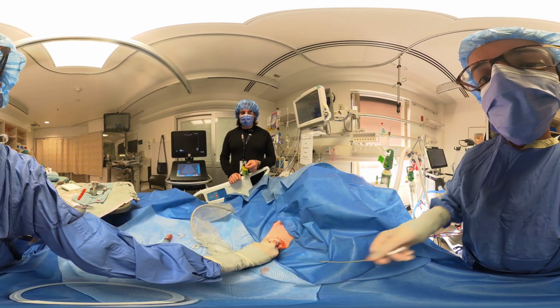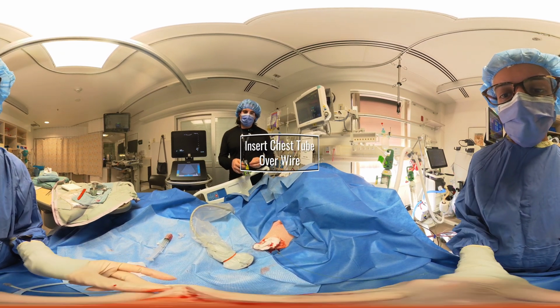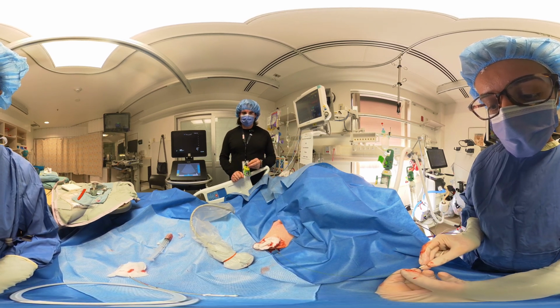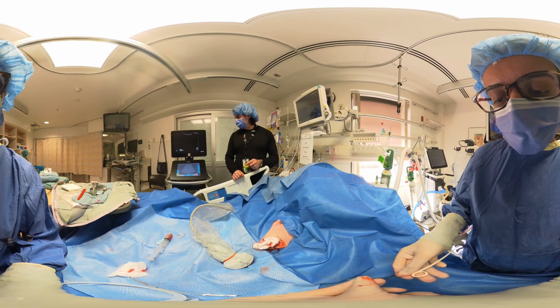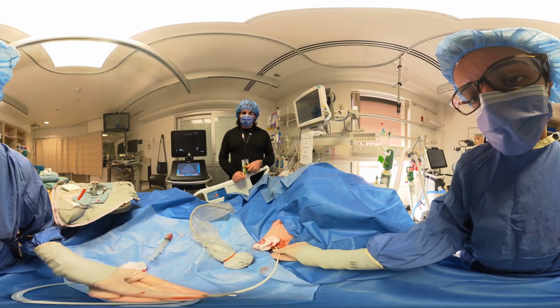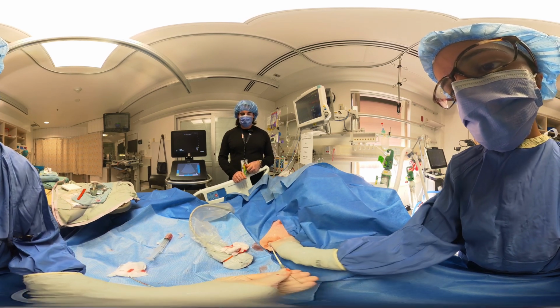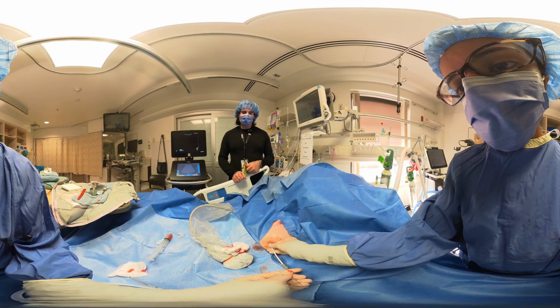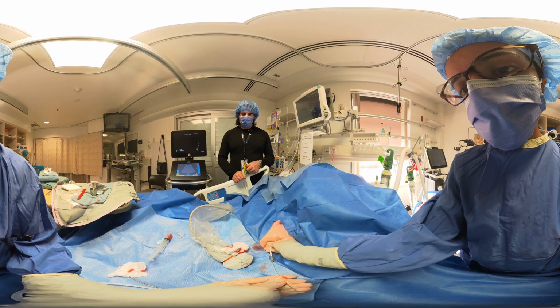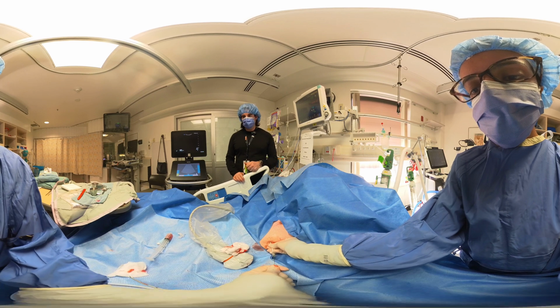Okay, if we're happy with that, we can now unfurl the pigtail over the rear end of the wire. Just being sure here that the wire is not a very long wire, so let's make sure we don't leave too much of it outside the chest wall. So there we go, just threading the wire. So this will pass directly over the wire, and being sure not to pull the wire as we pass it. Okay, so pass it, only leave about an inch out, so he can keep going with the tube. Excellent. Okay, perfect. Okay, let's remove the wire.